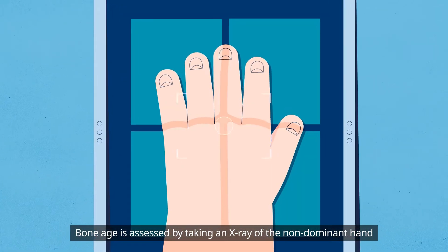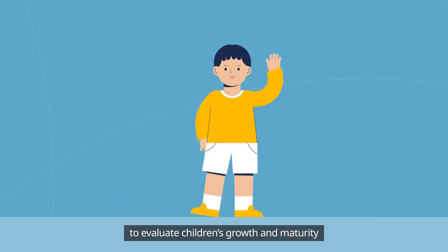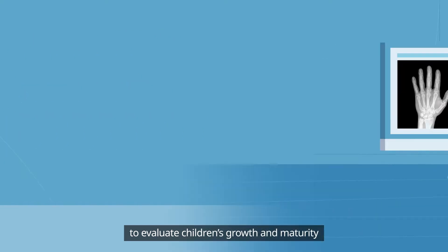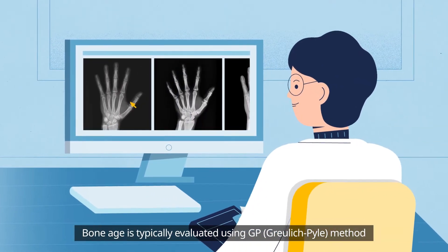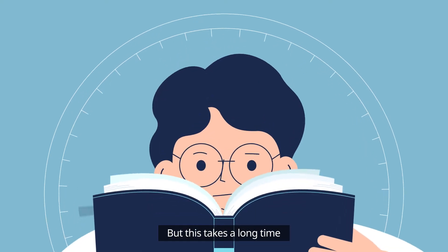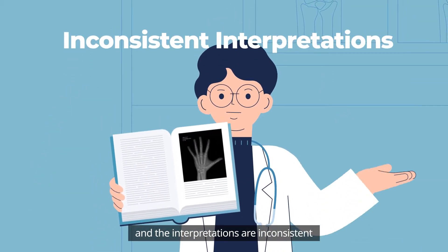Bone age is assessed by taking an X-ray of the non-dominant hand to evaluate children's growth and maturity. It is typically evaluated using the GP method and/or TW3 method, but this takes a long time and the interpretations are inconsistent.